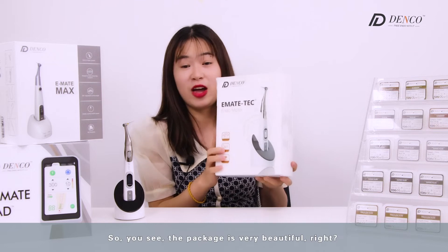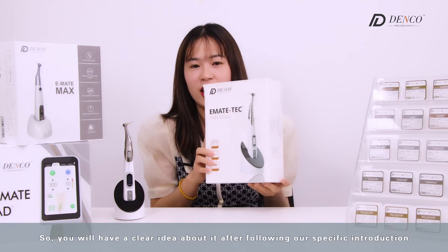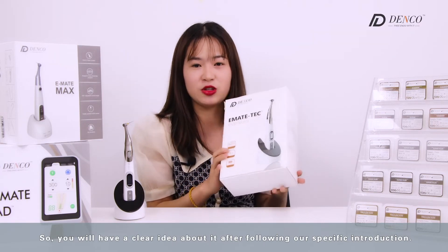The package is very beautiful. You will have a clear idea about it after following our specific introduction.